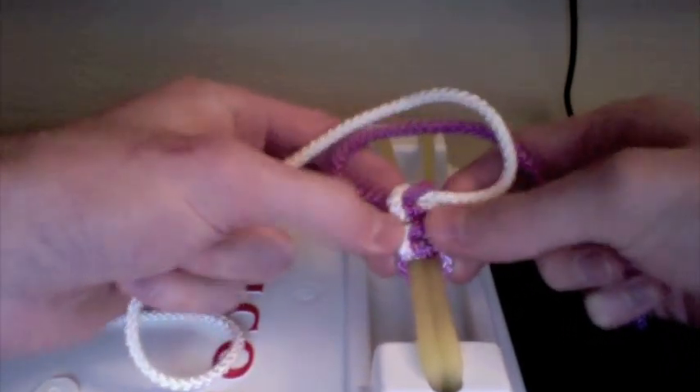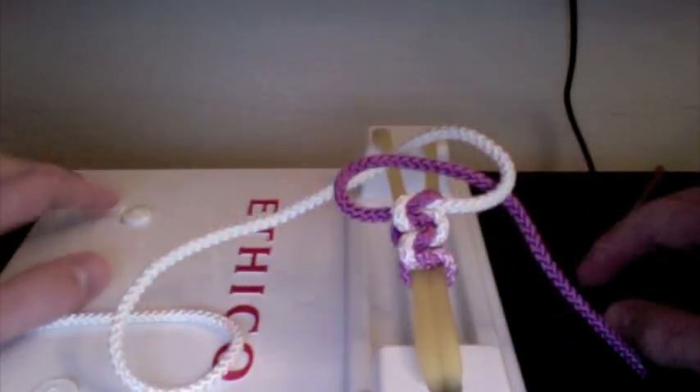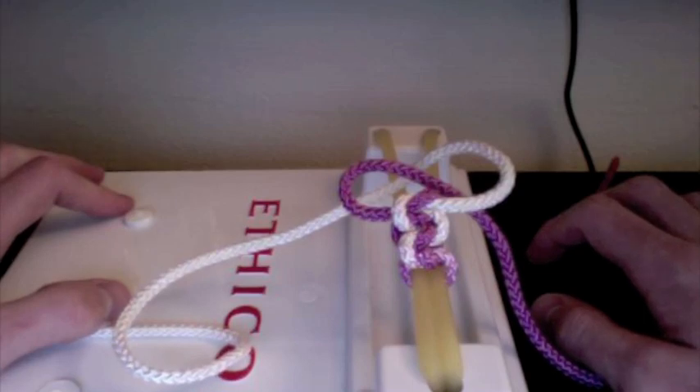If it doesn't look like this, be sure to straighten out your knots every time and make sure it looks pretty. So that's basically it. Check the description box below for links to the other two videos in this series: tying one-handed knots and tying instrument ties.